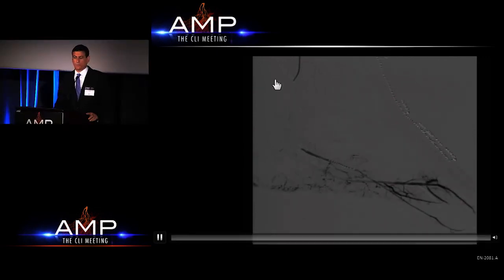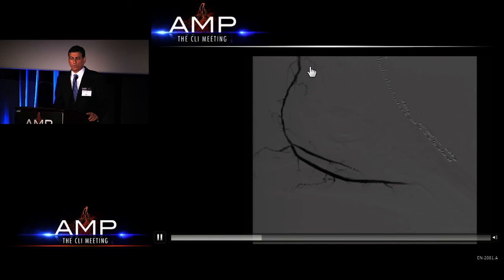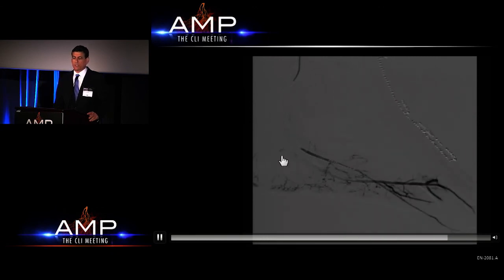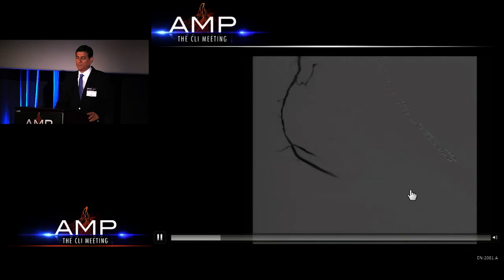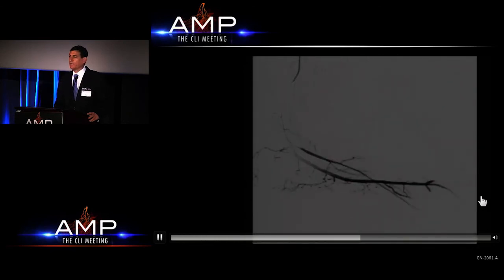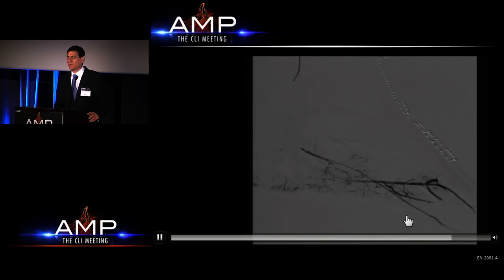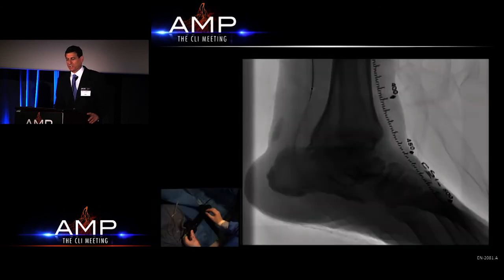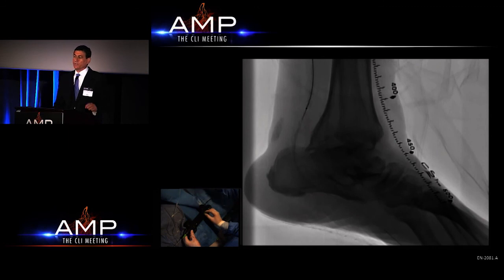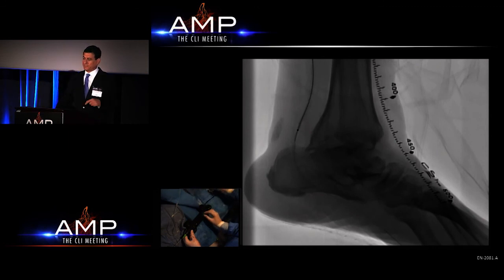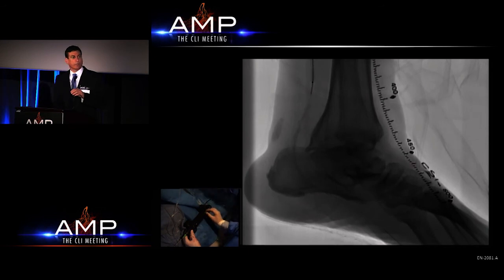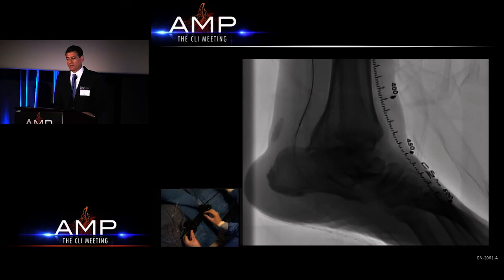This is the final image — a 0.035 catheter with direct injection into the PT and plantar arteries, and notice the sluggish flow. This is a very ominous sign in advanced disease, and we know this needs to be treated. We'll stop here and return to this case after the live case with Dr. Adams is done.